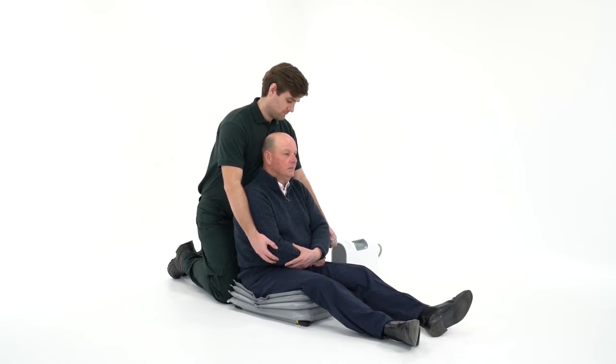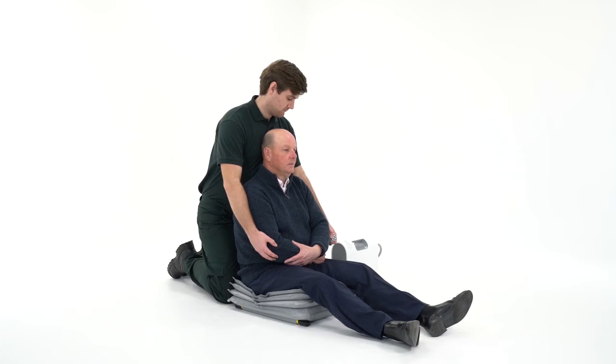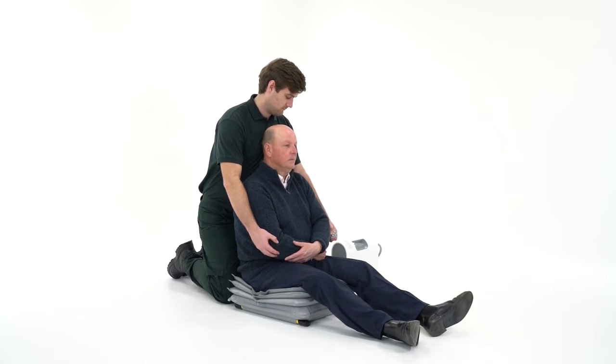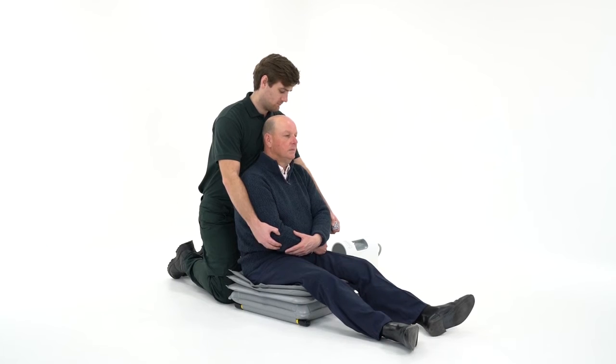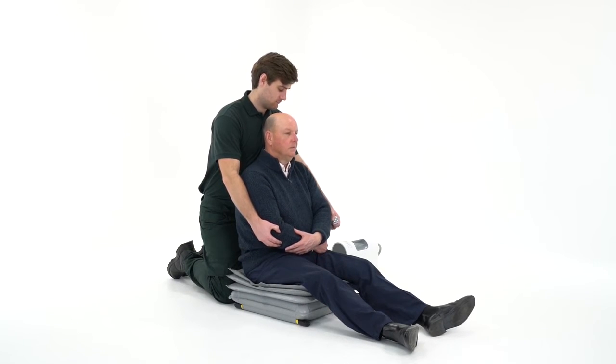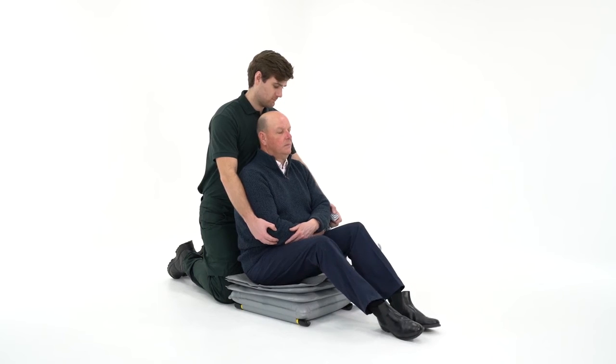The first section of the Elk will now start to inflate — continue to hold button 1. The airflow will stop automatically once the section is fully inflated. It's important for a safe lift that each section required is full before moving on to the next.